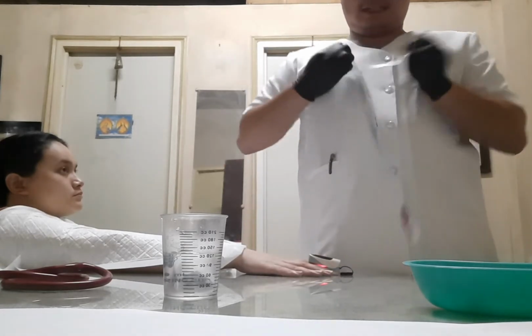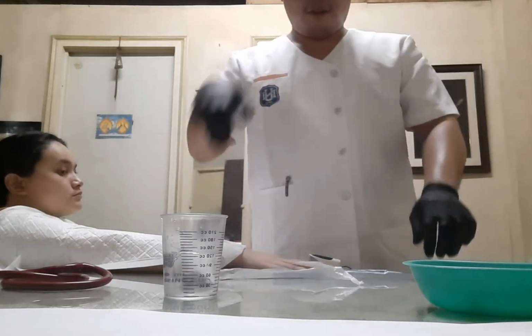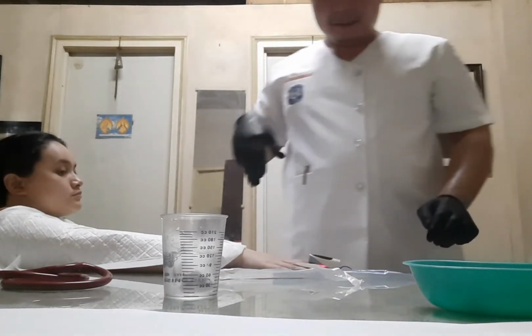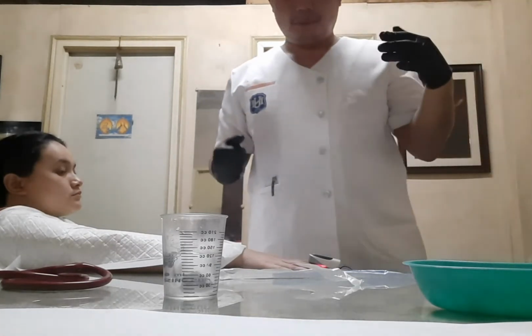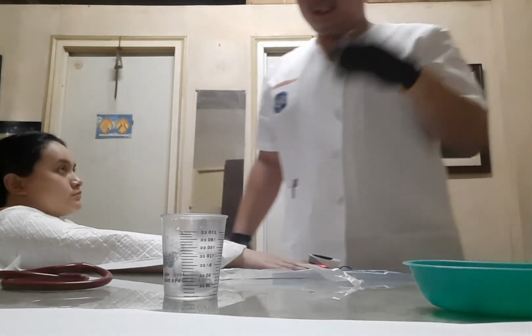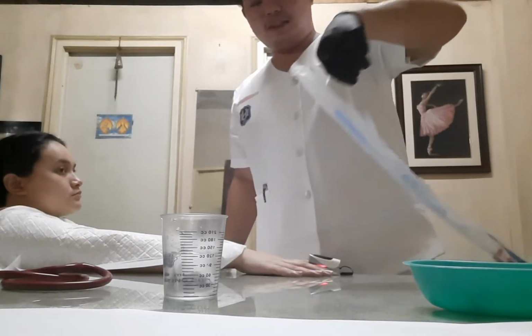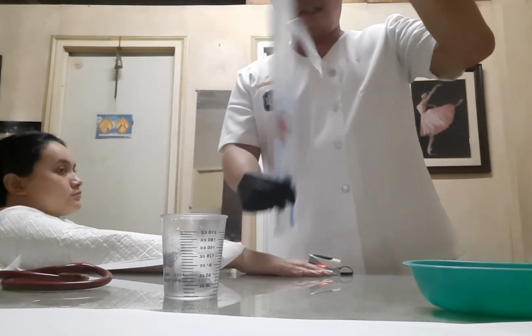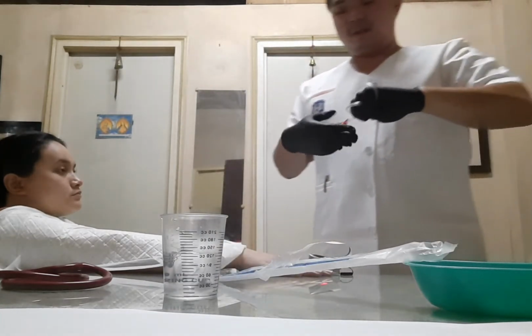Now, when opening the suction catheter, use your dominant hand, which is my right hand. It will be the sterile part or the sterile area. Once I hold the suction catheter, the other hand will be the unsterile part in holding this one.